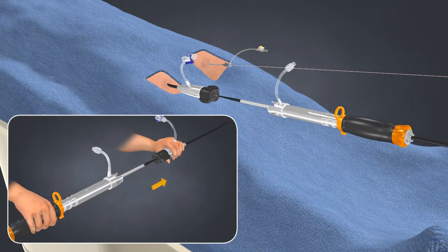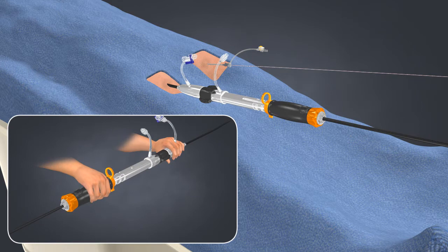Advance the extension delivery system until you hear it click. This transforms the introducer and the extension system into a single unit.